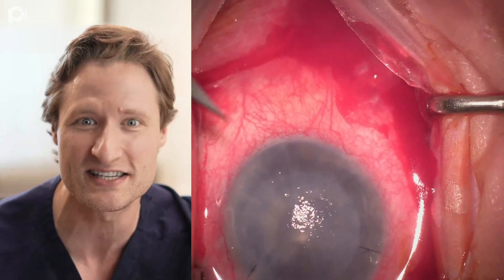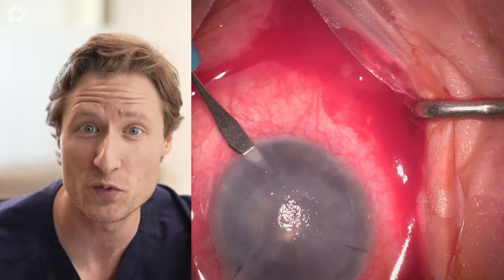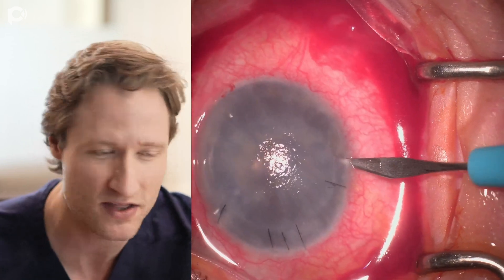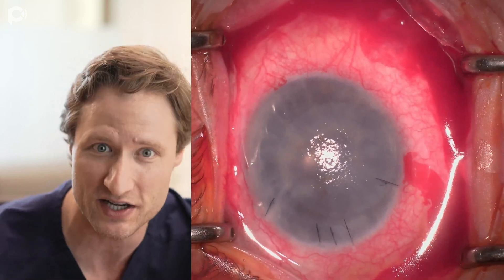I want to show you a classic example of just such a case. This is a patient we operated on last week in our office. He was referred by a very talented cornea specialist from far away. The patient had just had DSEC for corneal endothelial failure because of the tube shunt. Even though the operation went perfectly and was done by a wonderful surgeon, the graft detached in the immediate postoperative period.